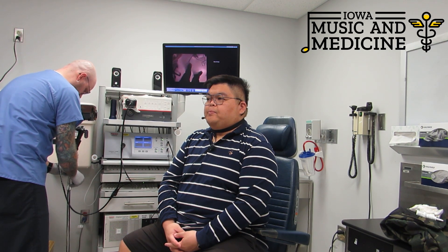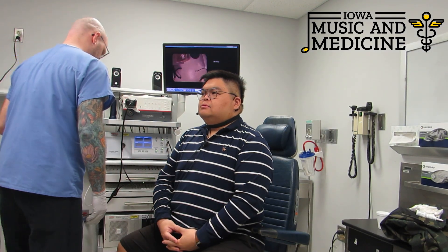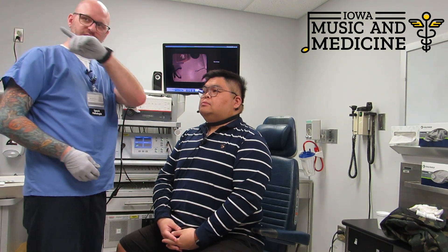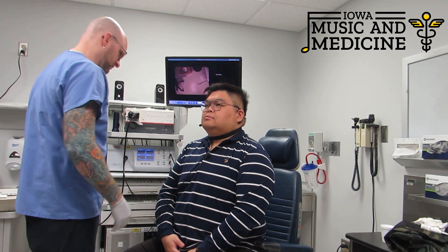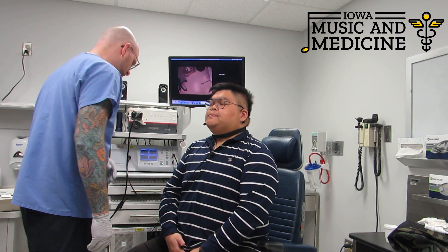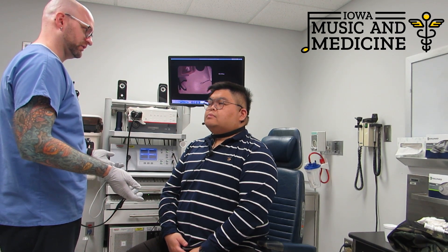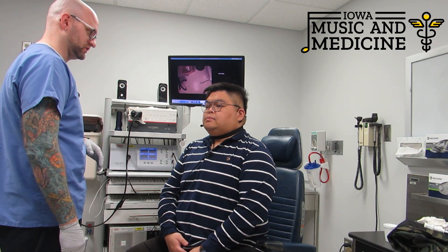But most people tolerate this really well. And since you used the afrin to open things up, I think we're going to be well on our way. So you're in a good sitting position, sort of up and forward toward me. You'll be able to see on the screen behind me exactly what I can see on my screen. I may be in your way when I'm placing the scope, but once I get things into place, I'll try to move off to the side so you're able to see the screen as well. We'll have you do a few of our standard vocal tasks once we get into place, and then once we're done with those, we'll have you sing a little bit.